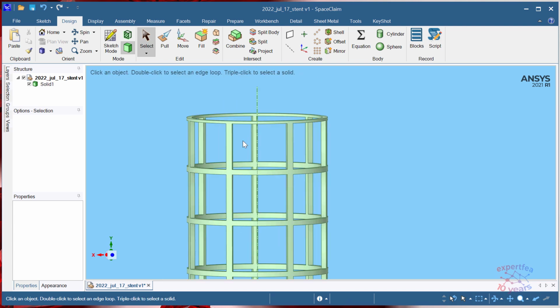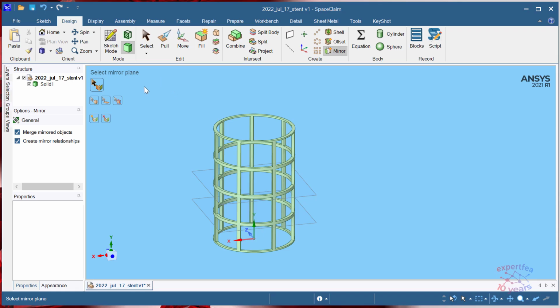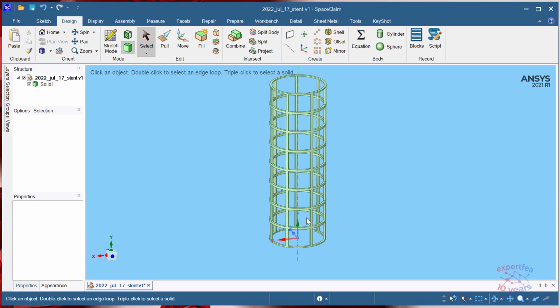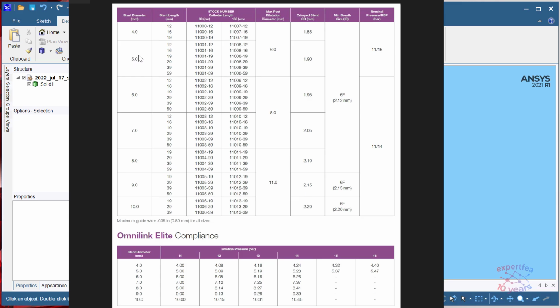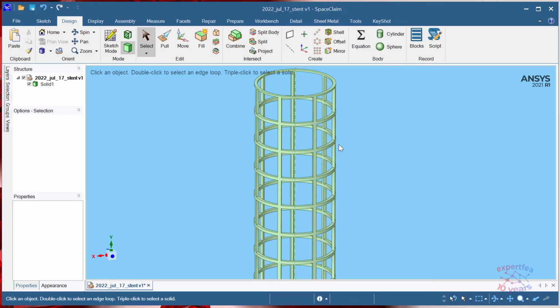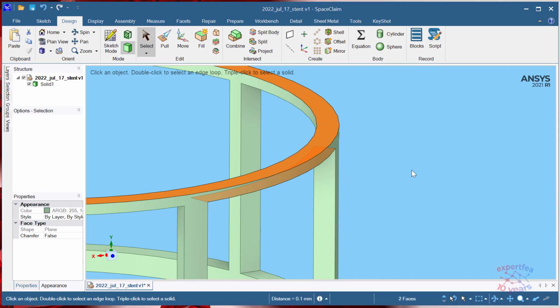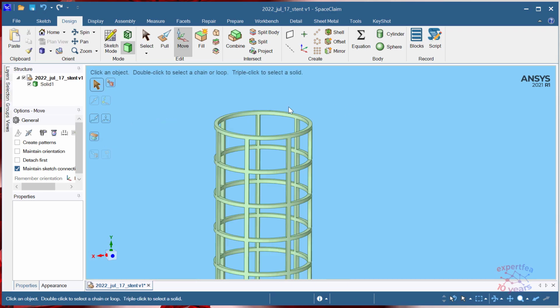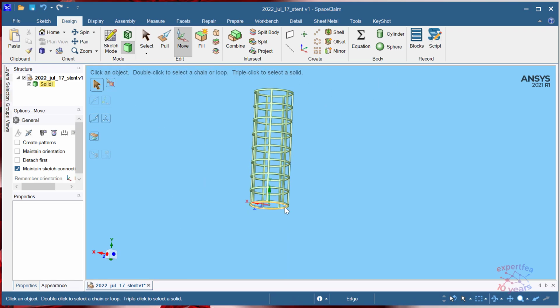Let's not be picky. So having 8 instances, 1, 2, 3, 4, 5, 6, 7, 8, multiplied by 2, we have 16 millimeter, which is, yeah, in accordance with what we have here, 5 and 16. As, yeah, regarding length. Because this thickness is 0.1, let's make it 0.2, you see here, 0.1. I'll pull it with 0.1, 0.1. Let's see here what thickness we have, 0.2, alright, we are covered here.